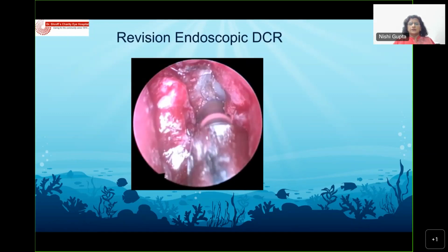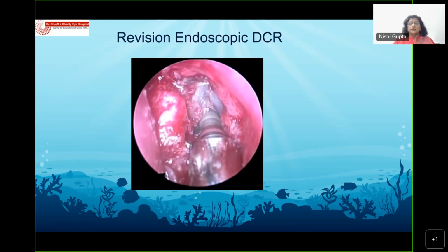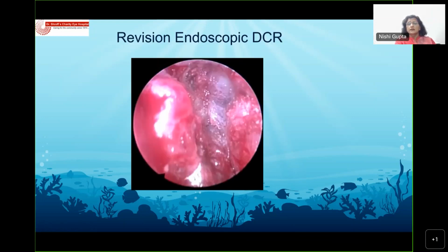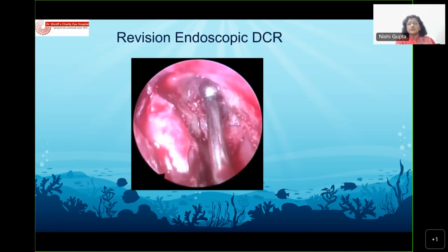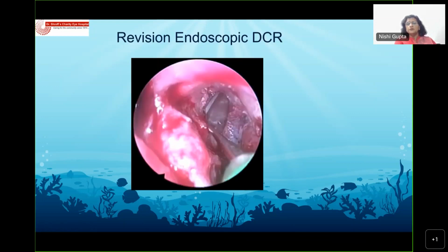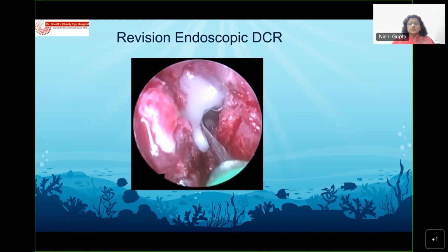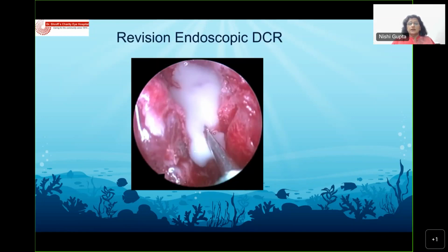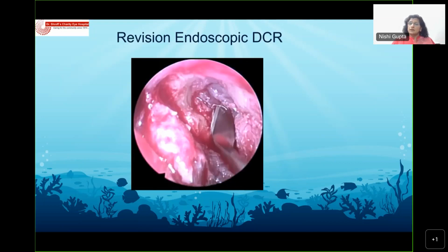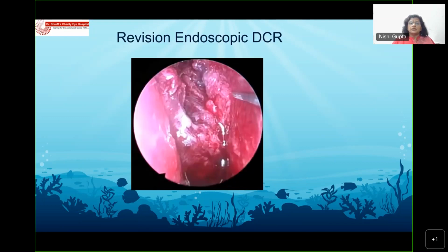This is a very old video, but this is an example of how many attempts were done on this particular patient. He was a poor gardener who was referred from outside, and she was crying and he was crying, saying do something, hopefully you can do something, everybody has tried. But of course this is an old case, some 5-7 years ago. Now a lot of people do good DCR surgery, but I showed it so that everyone knows that this superior part needs to be exposed. And if no remnant of the sac is left unexposed, then the outcomes are excellent. See, inside the sac, inside the lumen, it is so thick.